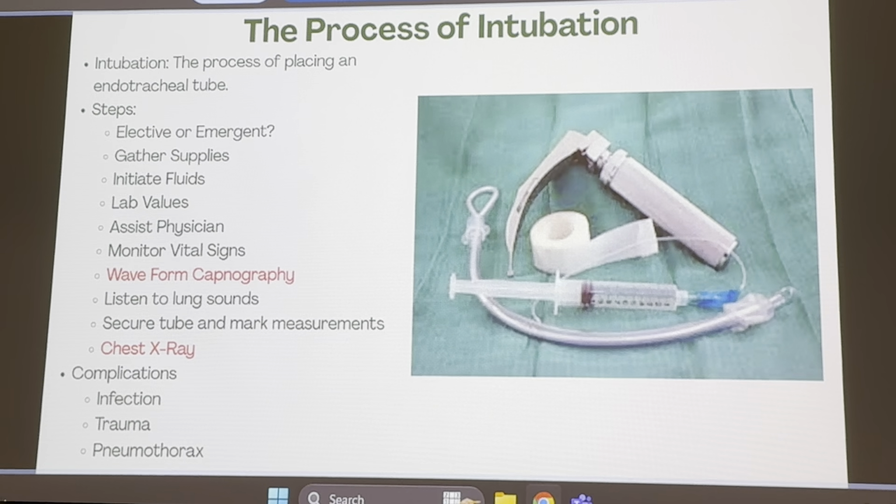As the physician is opening up that airway and looking down, you have to think about all those nasty secretions that might be up there. Maybe there was some trauma. Maybe we have to suction out some of that blood as well. So we definitely need some bedside suctioning, if at all possible. What else?